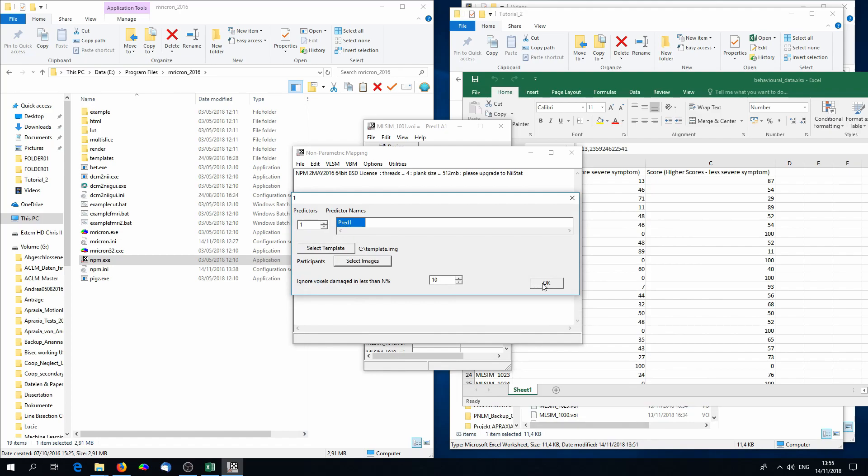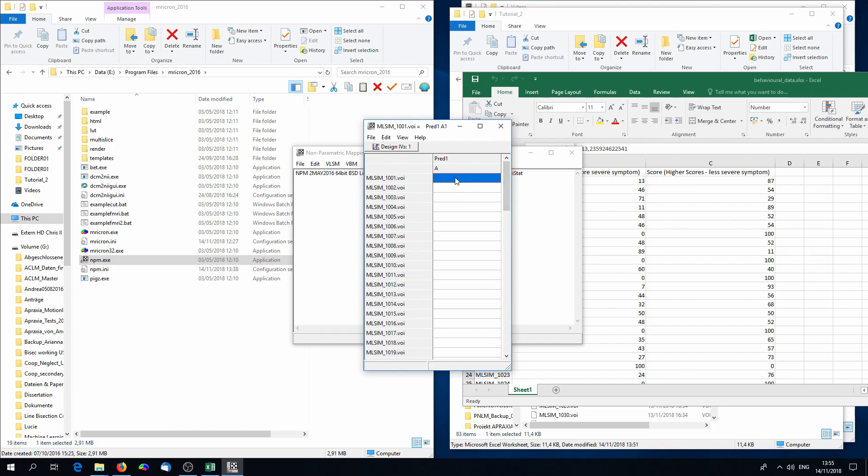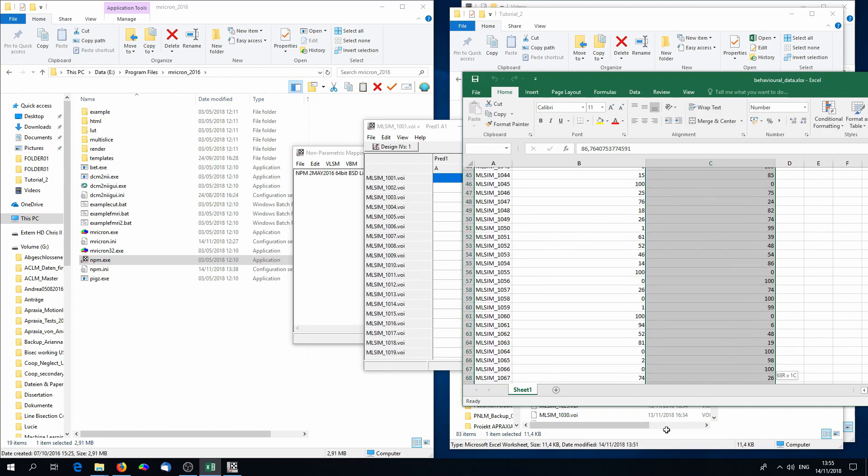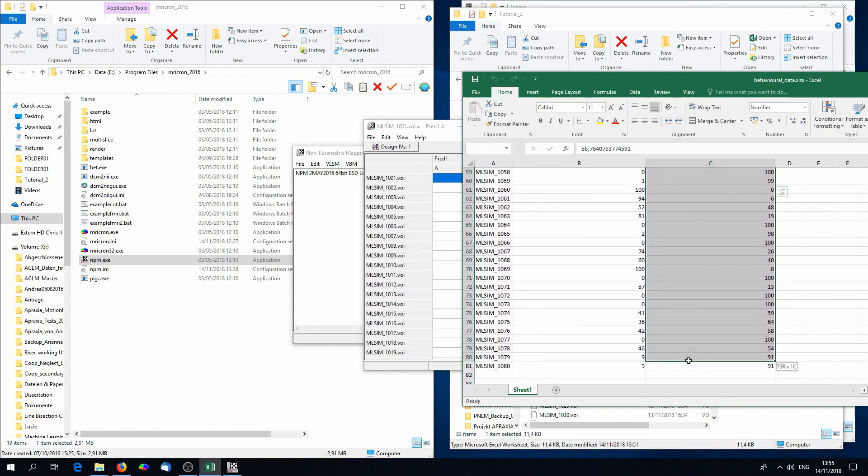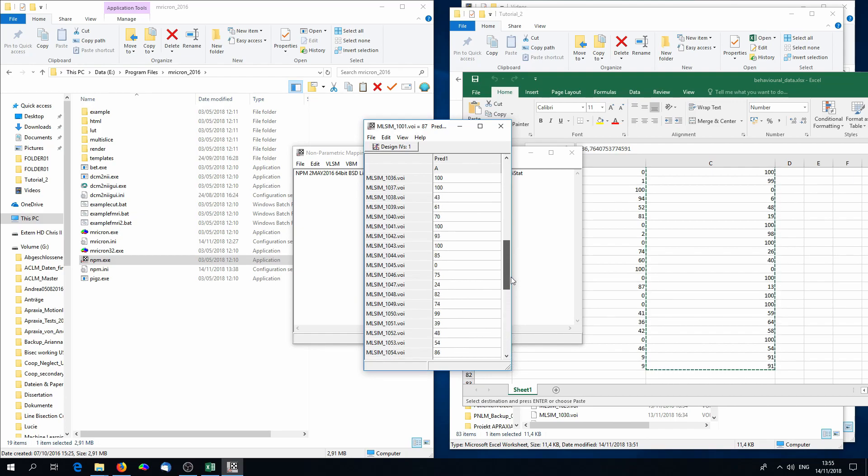Click on OK, and again on OK. Then we'll come to this menu. On the left, you will see the name of the lesion images, and on the right, you'll have an empty column. You can copy-paste the behavioral scores into this empty column, and here we need the right column, where higher scores mean less symptom. Just copy-paste it into the empty column.